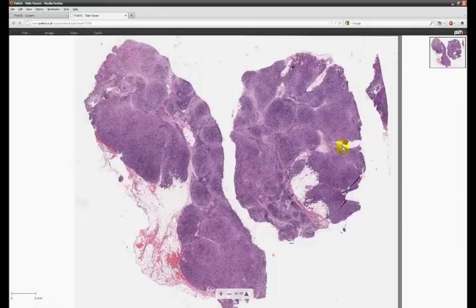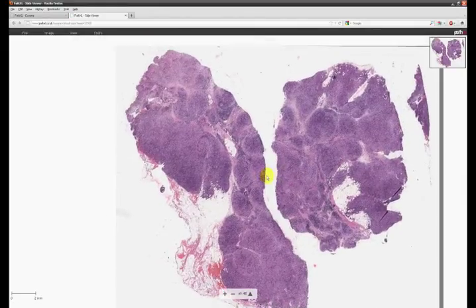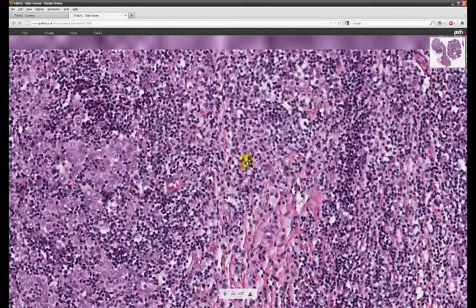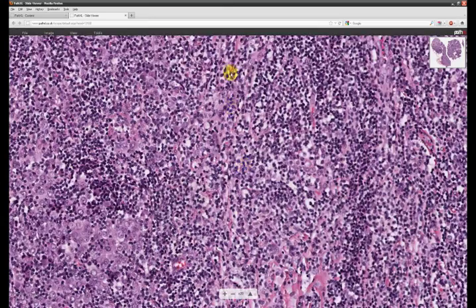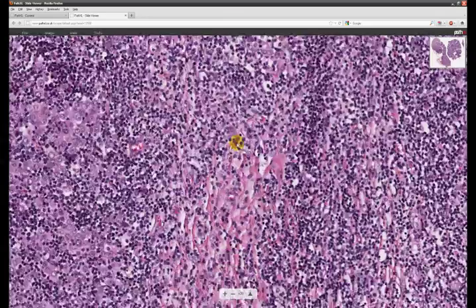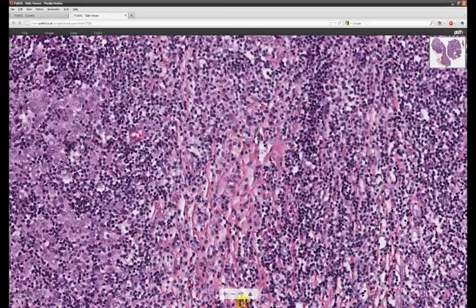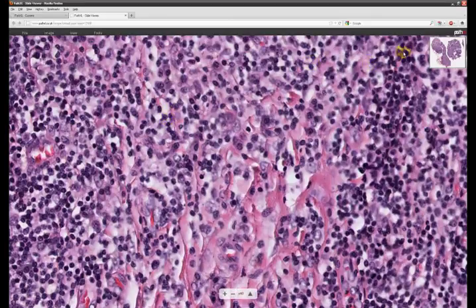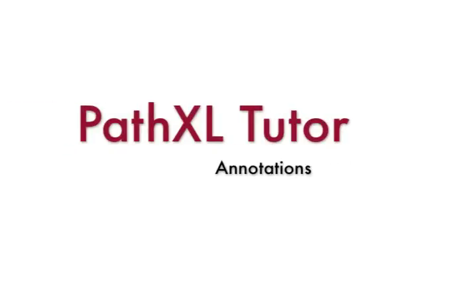This next digital slide is a tissue section of a breast cancer, showing a complex lymphoepithelioma-like lesion. Again, the whole tissue sample is available and can be navigated and viewed at different magnifications. This specific slide was scanned at ×40 objective magnification, and so can be enlarged to ×40 to show individual nuclear detail at any point on the slide.